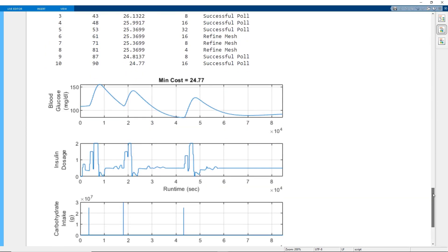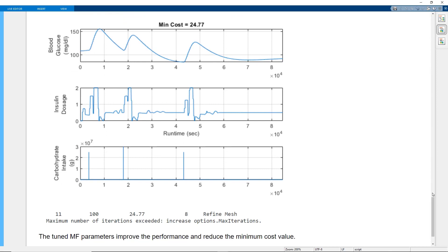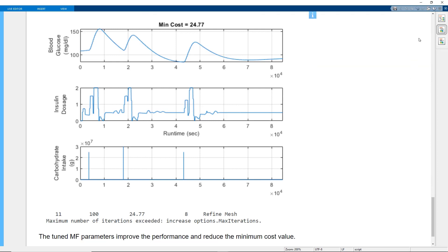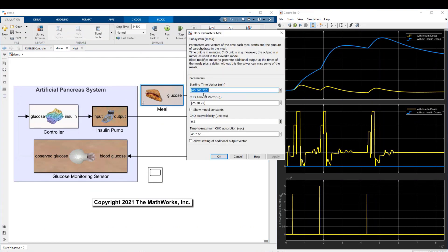This plot shows the optimization results with the tuned membership functions, which improve the controller performance and reduce the minimum cost value. You can now simulate the model with different mealtime and carbohydrate intake values to validate the controller performance.